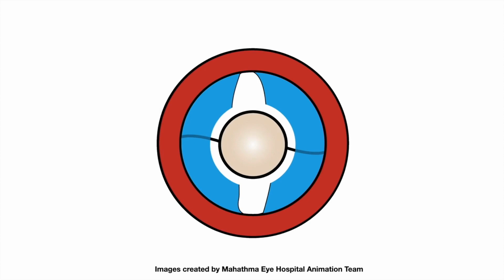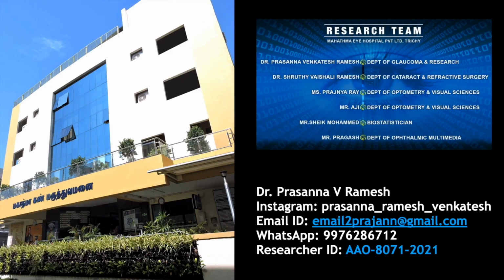By following these surgical tenets, one can break the hedonic cycle of Argentinian flag sign to gain access to a new world of wonder and joy.